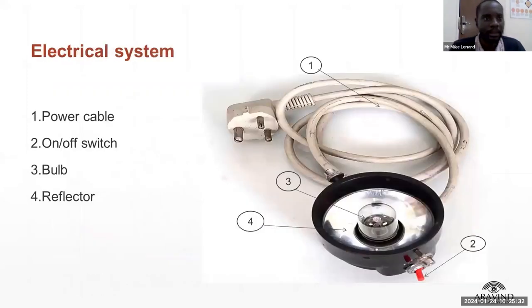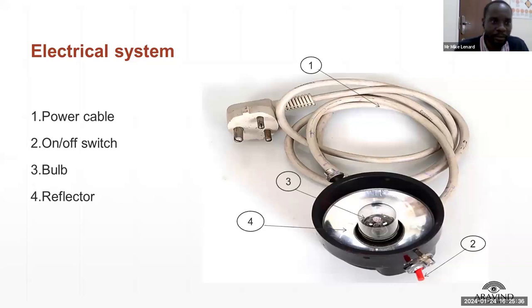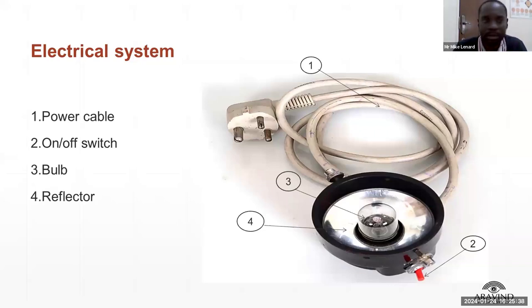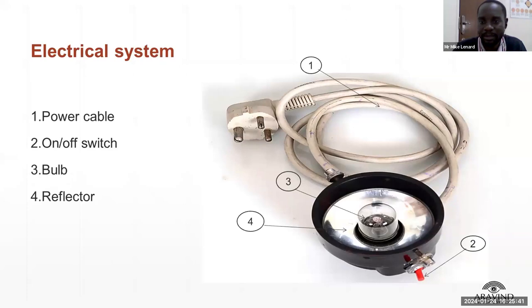The electrical system is composed of mainly four parts: the power cable, the on/off switch, and the reflecting mirror inside.